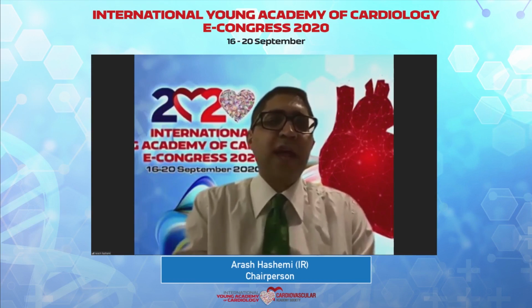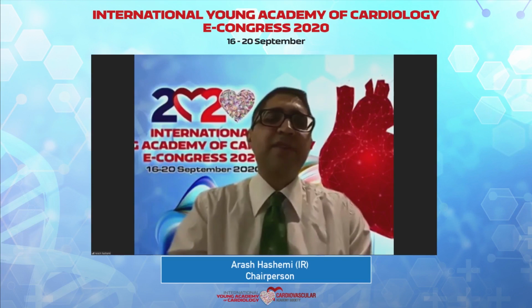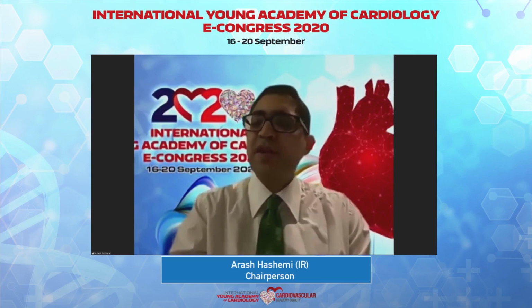First, I want to ask Italo Porto, do you have any comments about OCT usage in in-stent restenosis mechanism and how to treat it, whether to do just pulse dilation or drug-eluting balloons or just to stent it again? Because as I understand, if we can understand and appreciate the mechanism which made this in-stent restenosis, whether it's neointima proliferation or neoatherosclerosis, we can tailor our therapy based on the findings. Do you have any inputs on that?